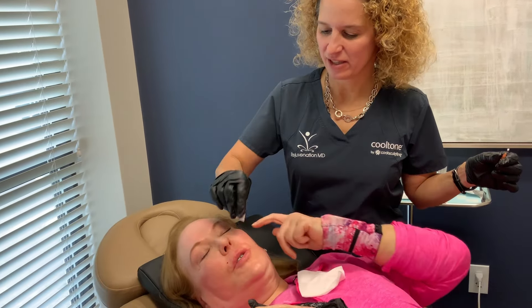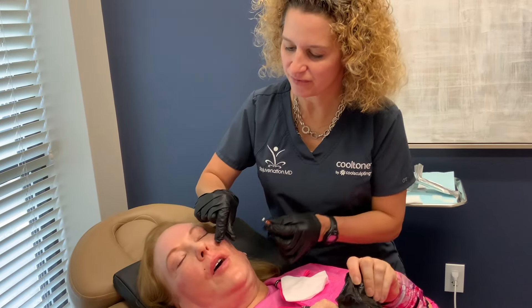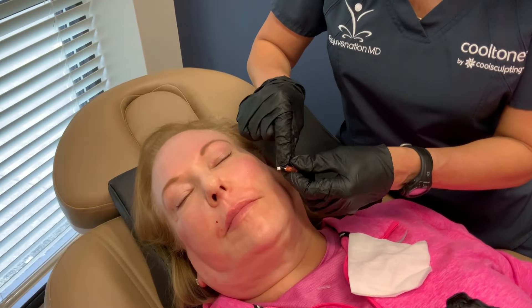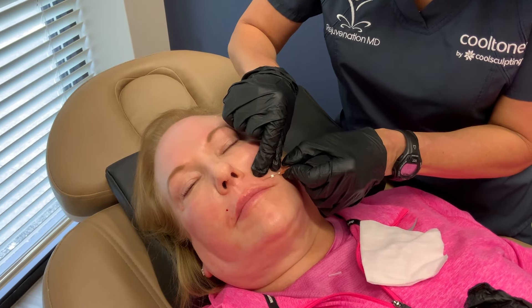Patient: Can we do them up here too? Yes, you can do them around the eyebrows too. We'll see how the Agnes goes and then go from there. One, two, three.